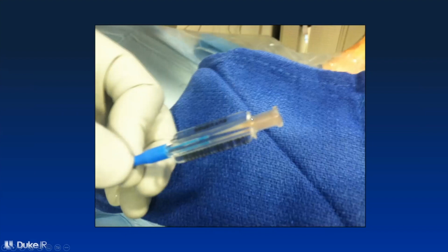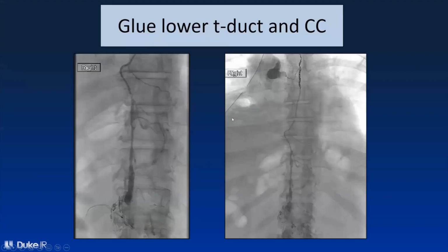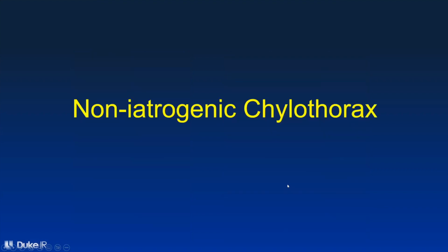Here you can see chyle in our microcatheter. And now we're going to block that leak using a variety of embolization agents. You're seeing coils here. Here is the leak. It's more evident because it's still below our coil pack, but we extended that coil pack across the leak, and then we glued. This is glue, not Lipiodol. This is glue, which is an embolic, basically sterile crazy glue. And we blocked that leak.